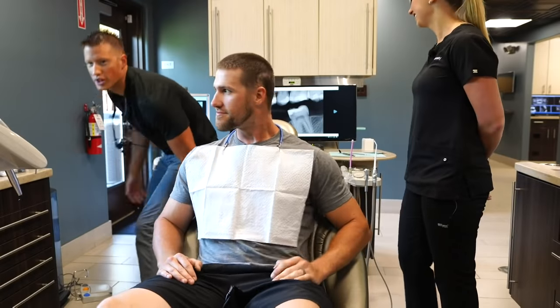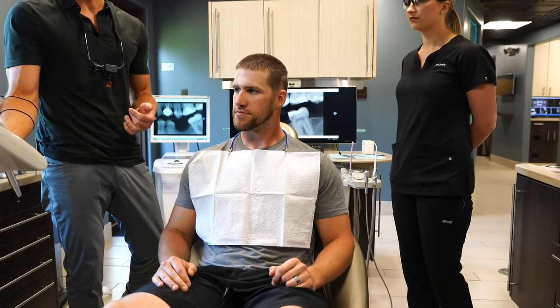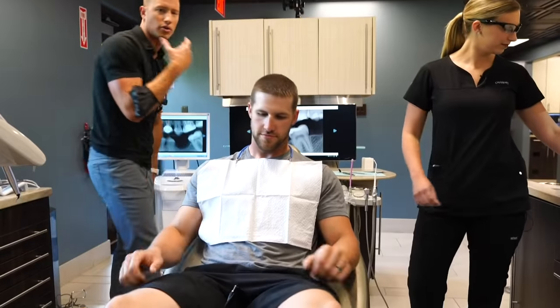So first things first, you wouldn't plan on building a house without first having some sort of visual aid that helps you know exactly where it's going to go. So your architect's going to draw up a plan. That's essentially what we're going to do here first for Trey. We want to make sure that this tooth that he's missing, it's his lower left tooth, and we might get a close-up here, Michael, so people can see that.